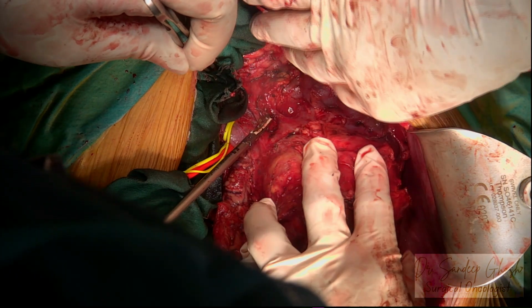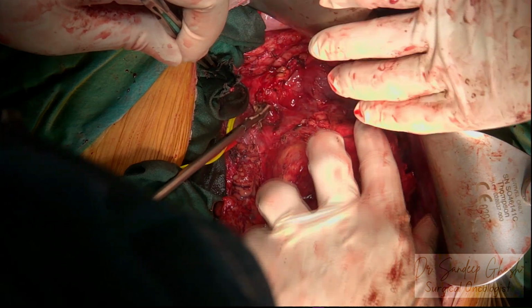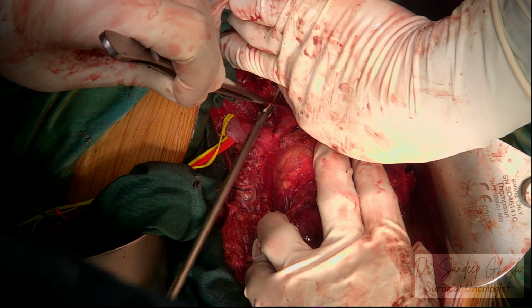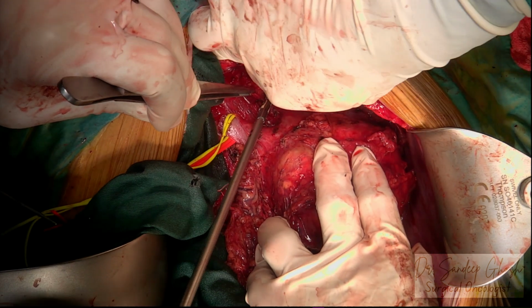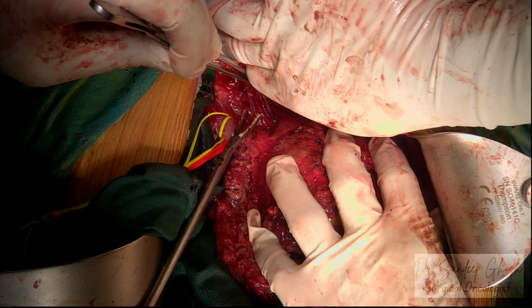Now that is the suprarenal vein which is being coagulated at two places and will be cut. Now the suprarenal gland is being separated here from the upper pole of the left kidney, and hence the suprarenal gland will be preserved in this case, as there is no involvement of the gland.